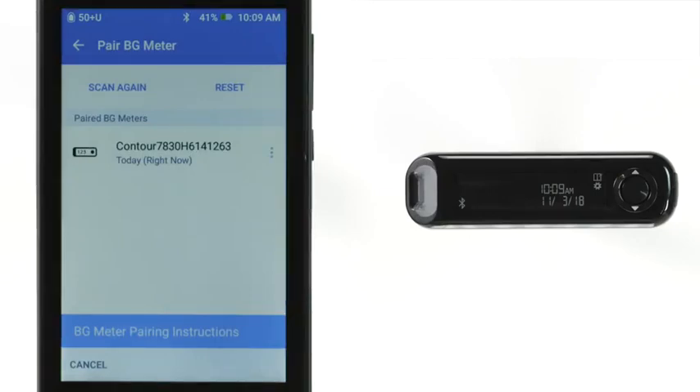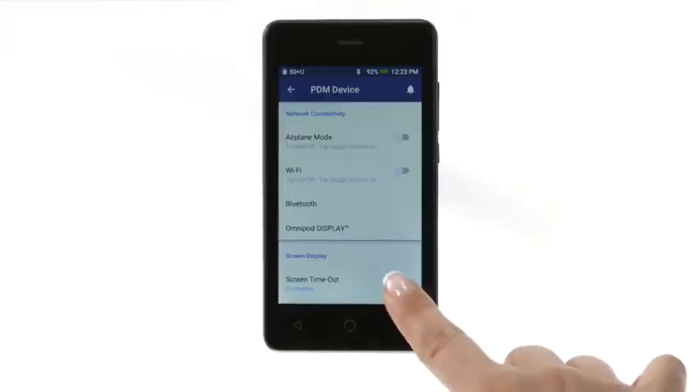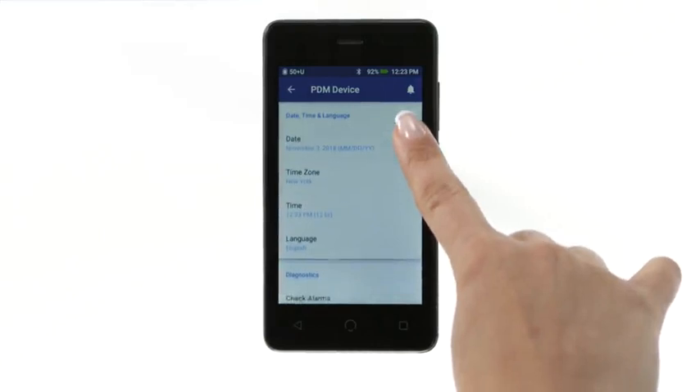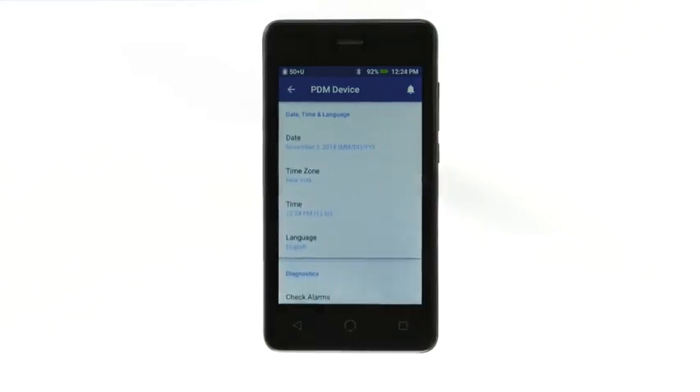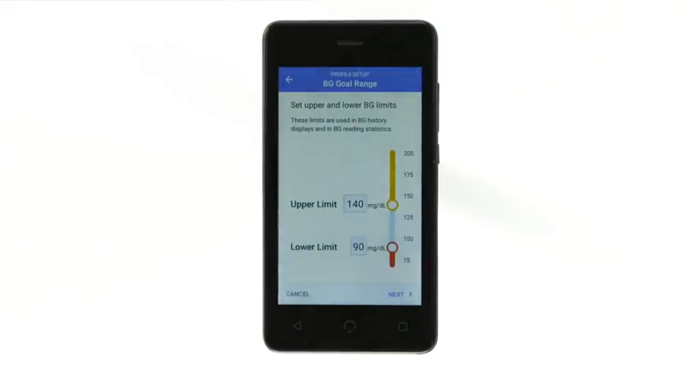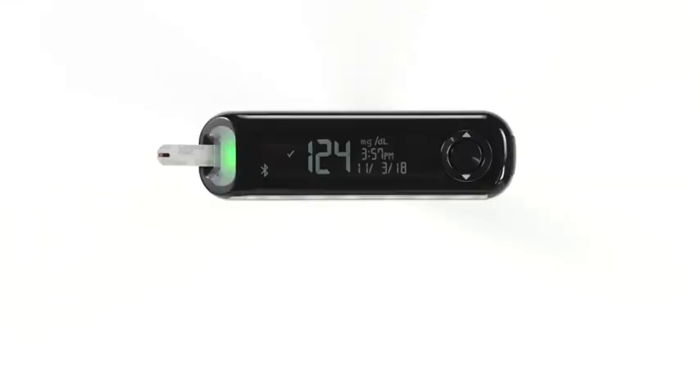Once paired, the PDM controls the date and time on the paired BG Meter. To avoid misleading or inaccurate history records, make all changes to date and time on the PDM, not on the BG Meter.